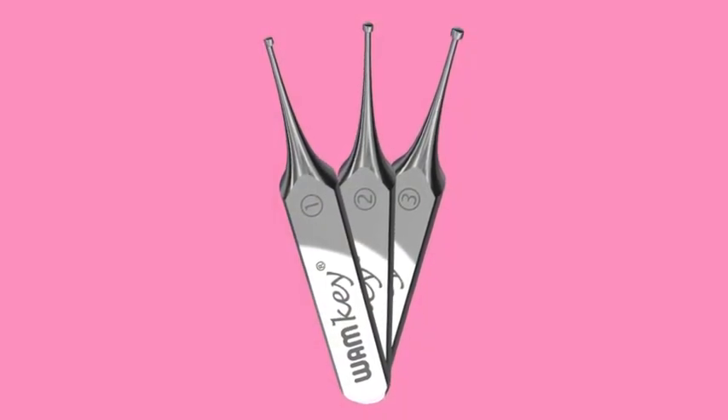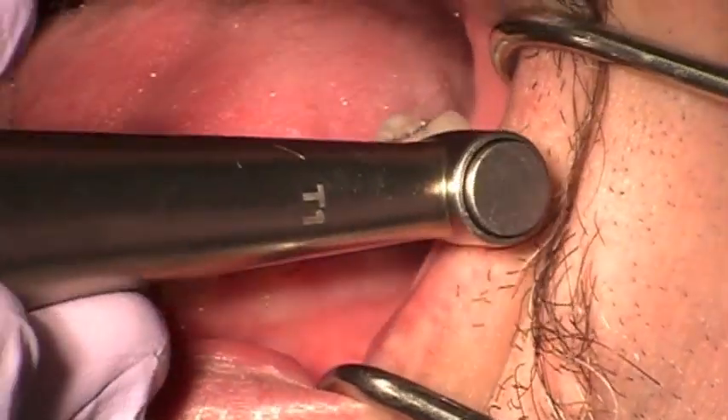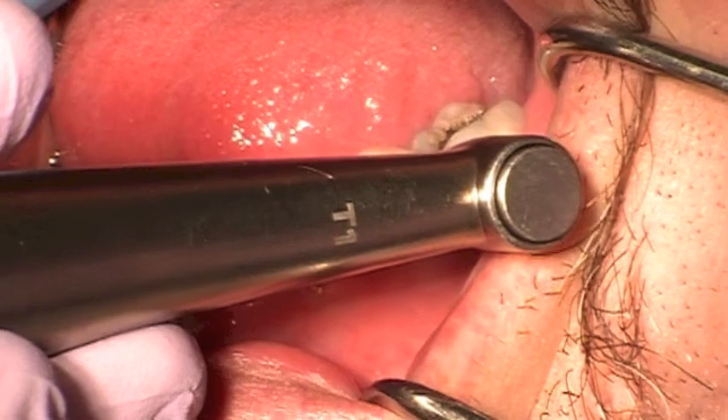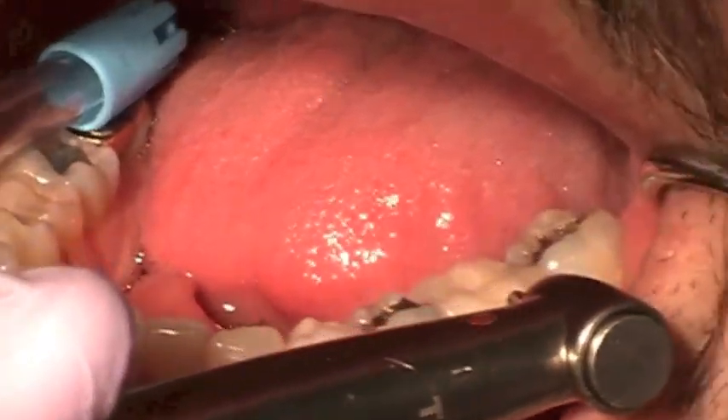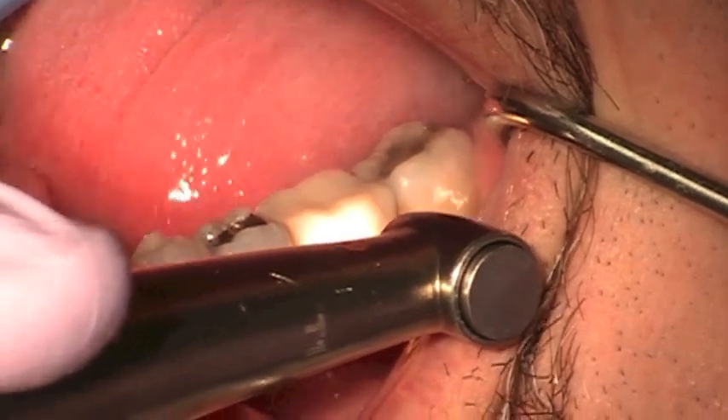What we're trying to do is establish where we estimate the crown height to be. I'm taking a metal cutter — this is a porcelain fused to metal crown — and I'm simply going to remove the porcelain and make a window. I'm going through metal.